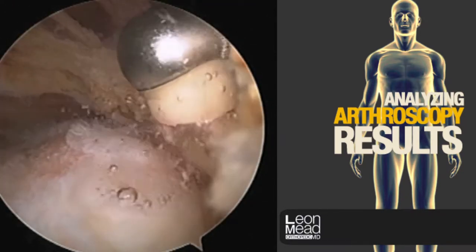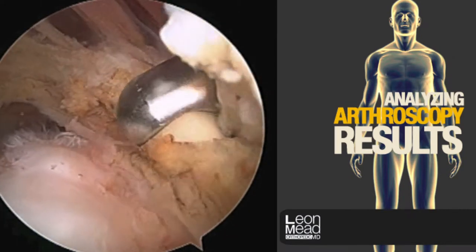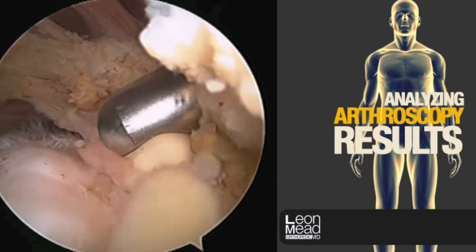It's imperative that we remove any scar tissue and bursal remnants so that we get a clear picture of what is healthy cuff tissue and what is not.